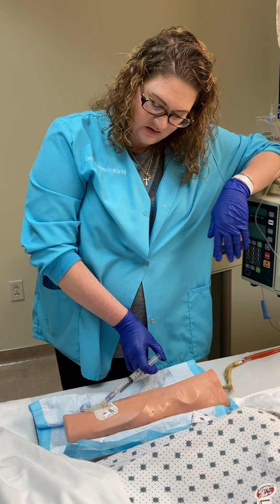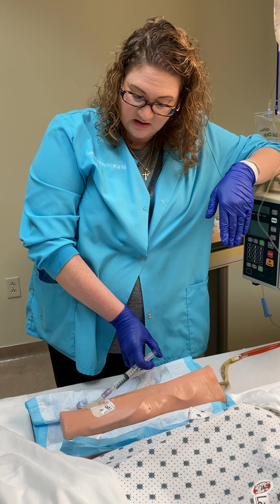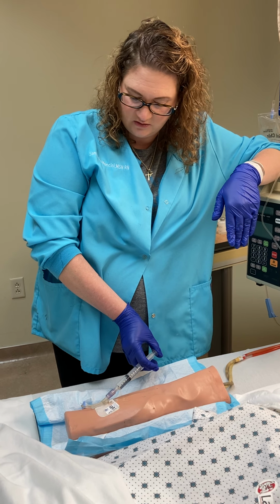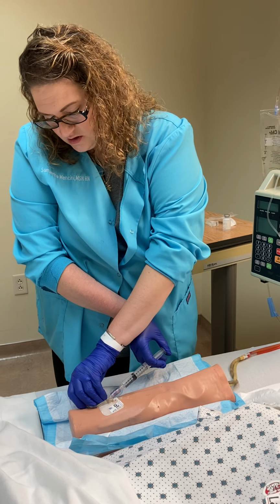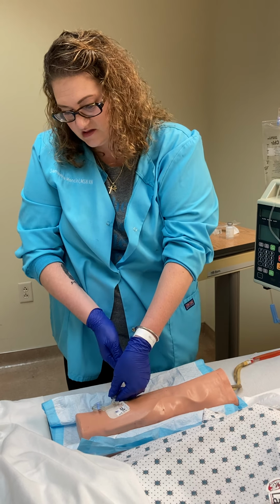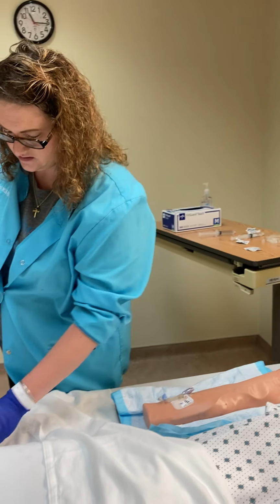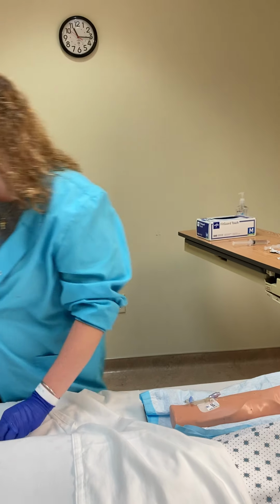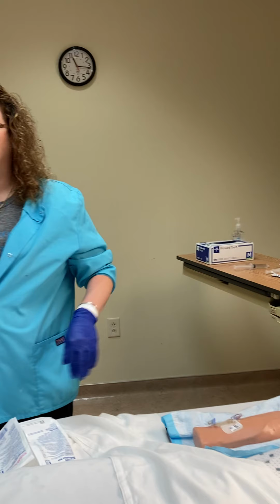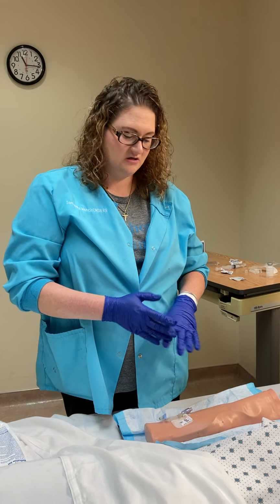So it's been, say, 2 minutes, and we've chased that 2 mLs of the Zofran. I'm going to continue to slowly flush to a total of 5 mLs to make sure that the medicine gets all through the J loop, and then I'm going to just clamp and disconnect. So that is your push through a saline lock. And I believe that is it for that. Continue to assess your patient.